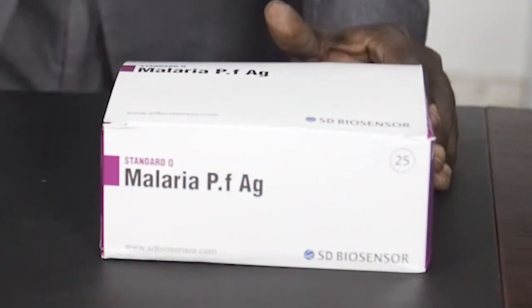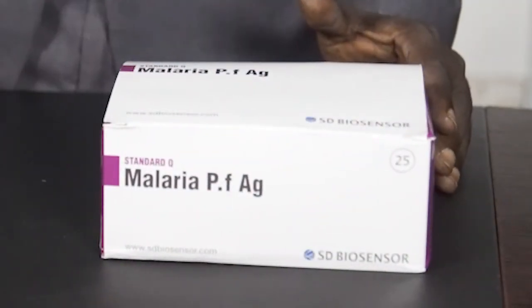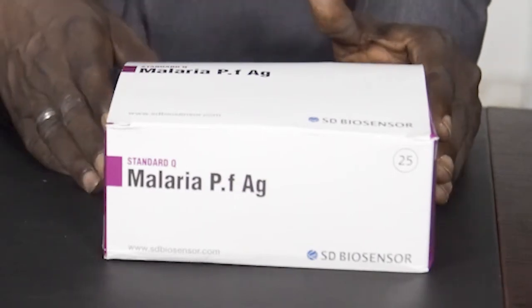Good day everyone. I'm going to take you through how to use SD Biosensor malaria test kits.